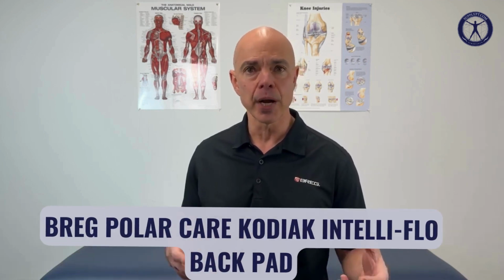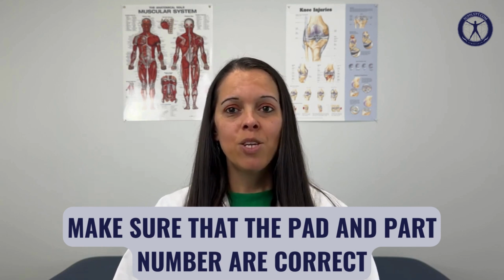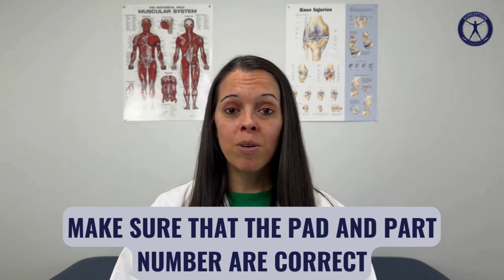All right, how do we do this? Michelle, take us through the steps of the application of the Breg, Kodiak, IntelliFlo pads. The first thing we need to do is make sure that the pad and the part number are correct. You would do this by looking at the front right corner of the pad where the part number will be listed on the white label.